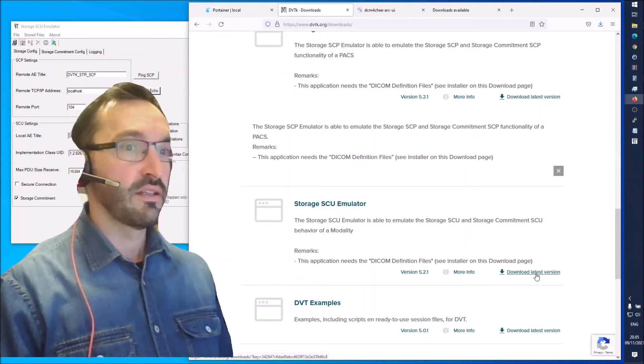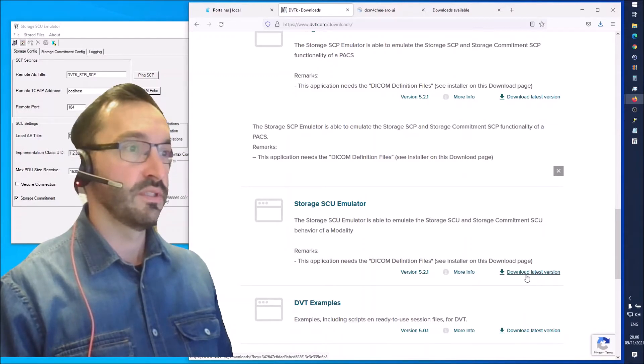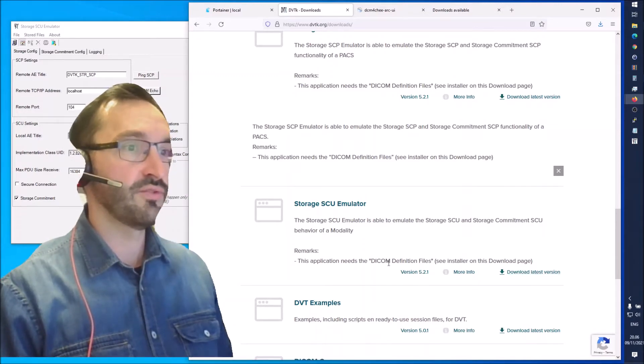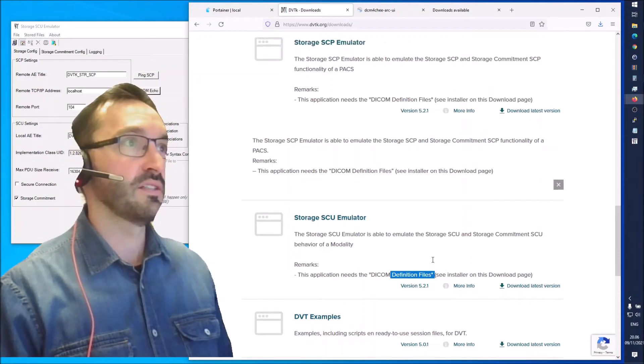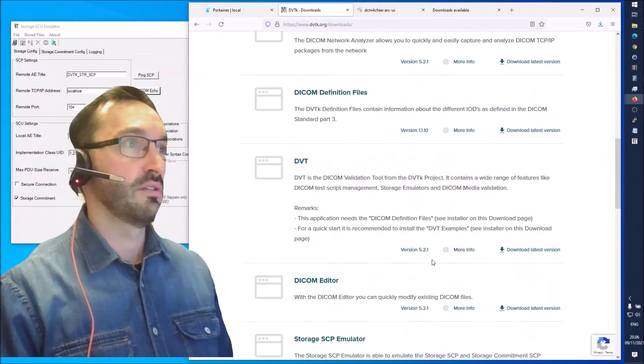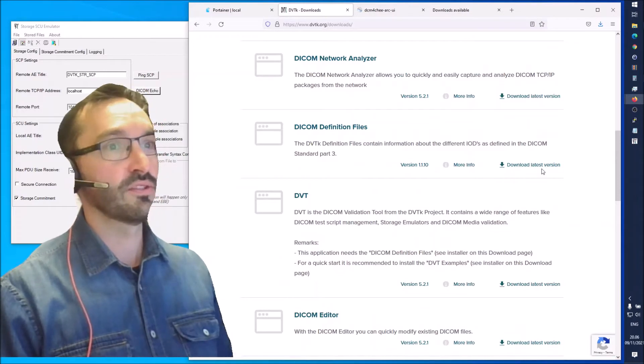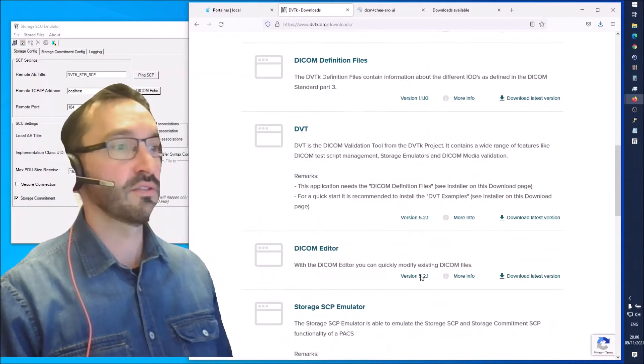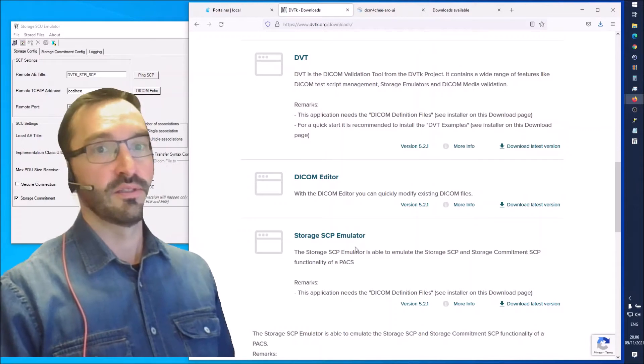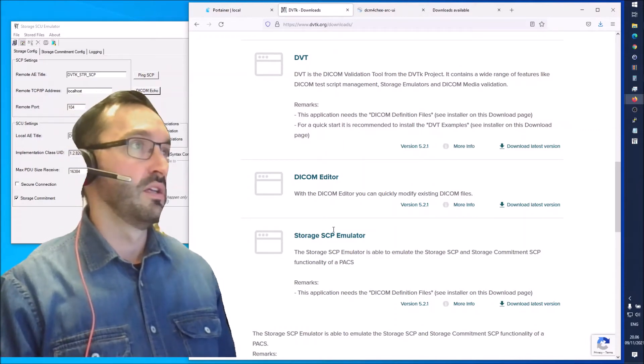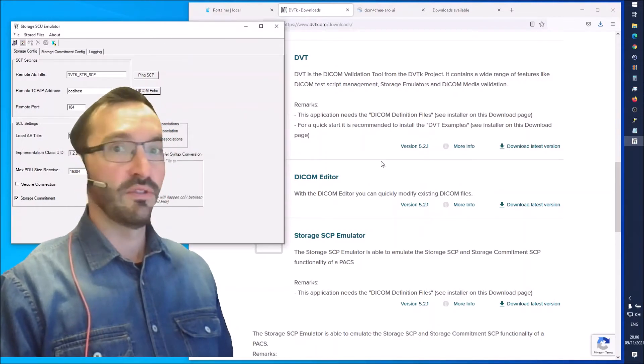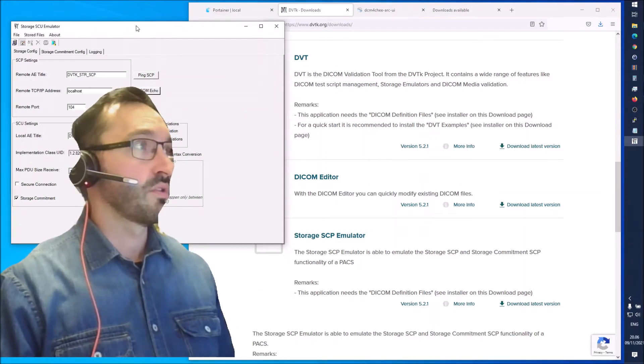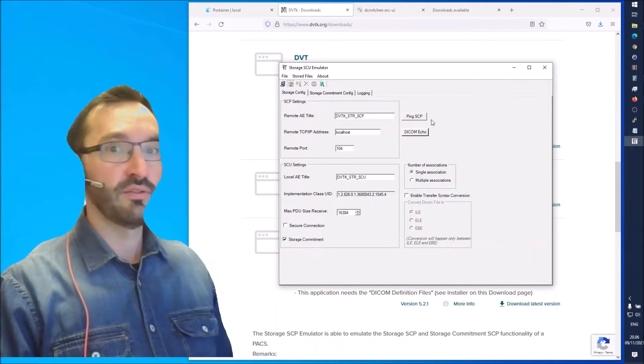Go ahead and download the latest version of this SCU emulator. You also need the DICOM definition files which are over here. Download that one as well. First install the definition files then install the emulator. They are simple installers so I trust you're able to do that.